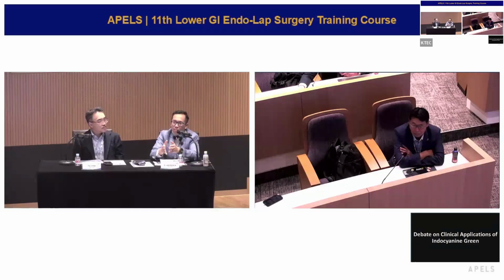But I believe what she showed is correct. If we want to use it, we have to believe it, or if we don't believe it, we have to redo the test again, because I think the ICG especially is good if you're doing everything intracorporeal. Extracorporeal, you can feel and you can see the blood better. Intracorporeal, there is sometimes a lack of the senses, and that is probably one benefit of ICG as we move towards more laparoscopic, totally intracorporeal surgery, whether it's right hemicolectomy or left hemicolectomy or anterior resection.